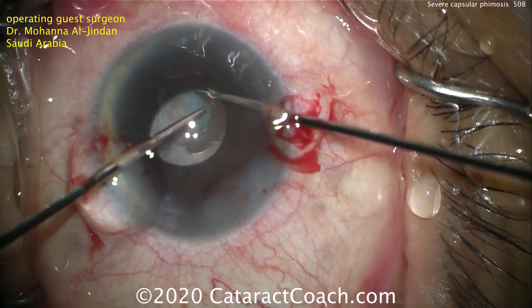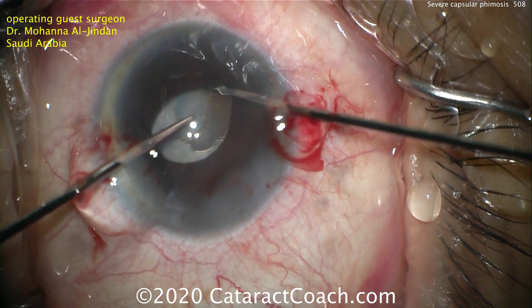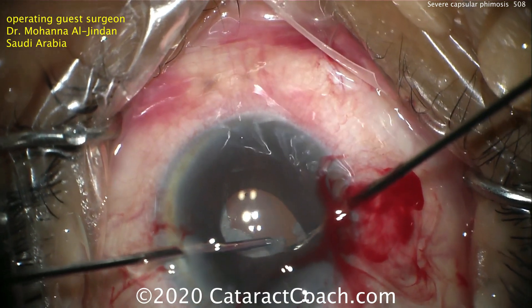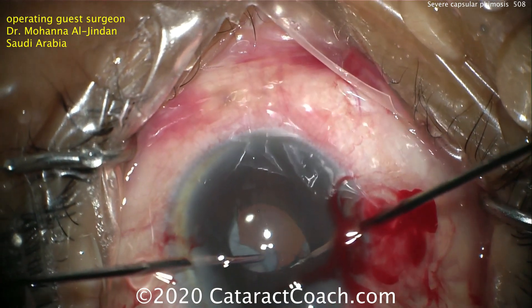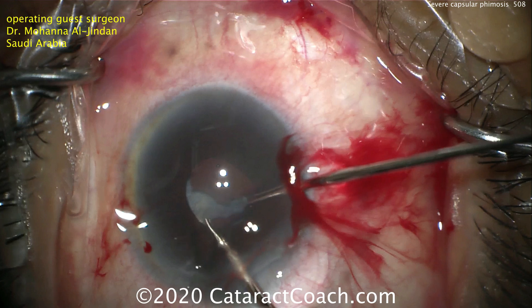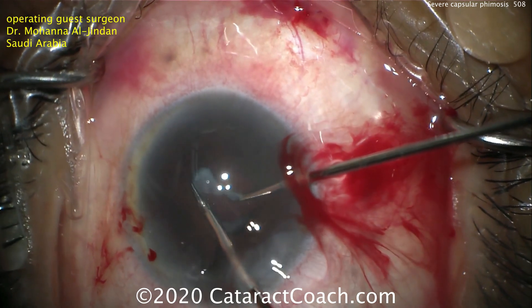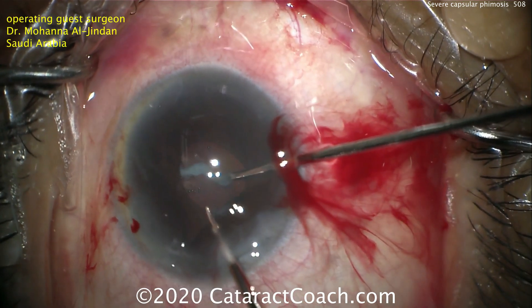This is going to expand the effective pupil zone for the patient, and this can be completed for 360 degrees. You can cut the size of the pupil that you'd like. Now switching to a different paracentesis and different approach, we can complete the 360. Another approach would be to use an anterior vitrector — a 23-gauge vitrectomy instrumentation — used on a relatively low cut rate to cut away and then aspirate little bits of this fibrotic lens capsule.